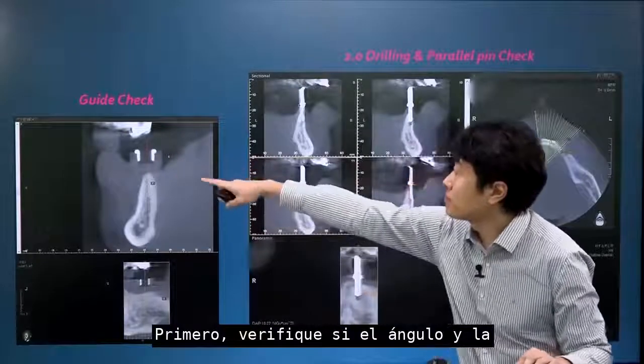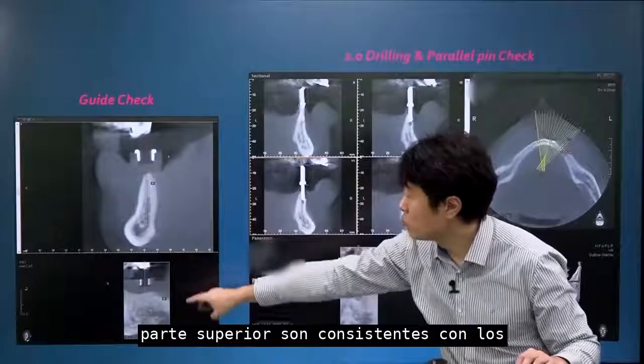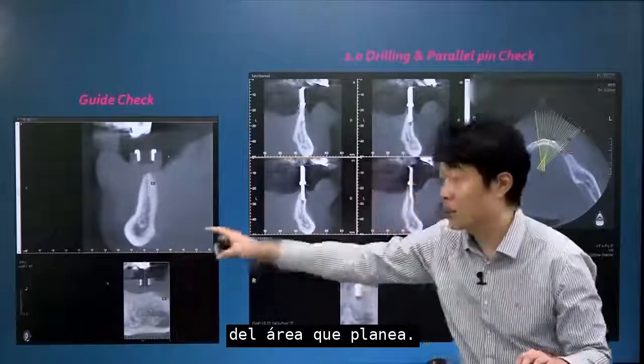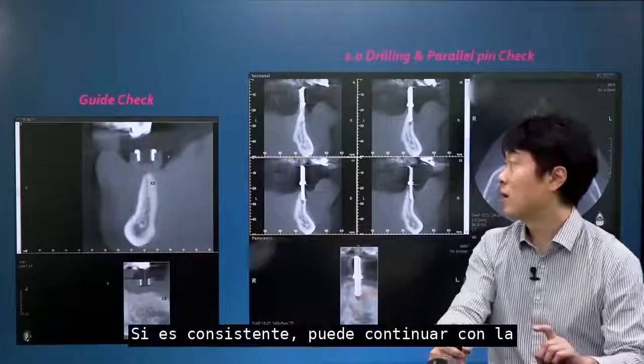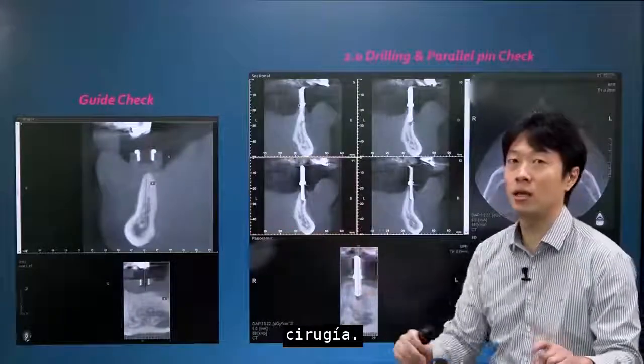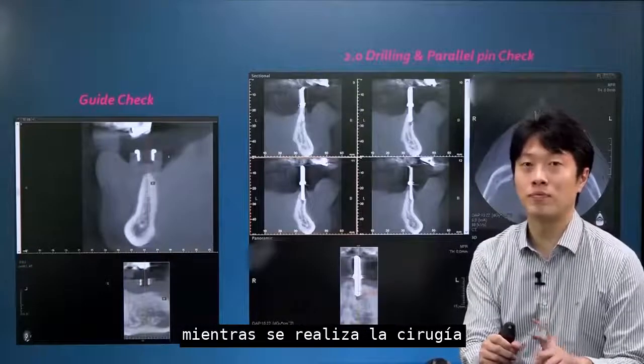First, check whether the angle and direction of the surgical guide at the top are consistent with those of the area you planned.